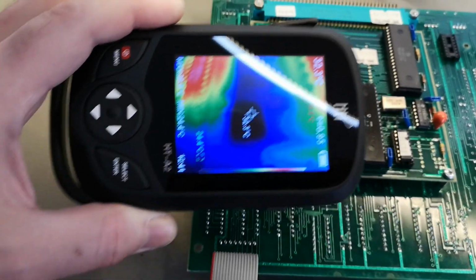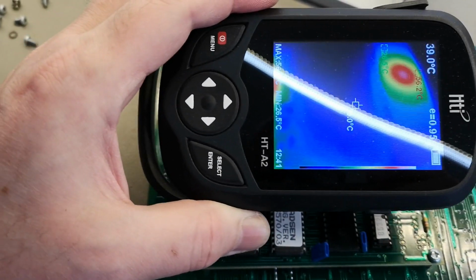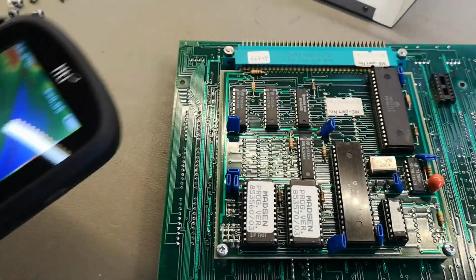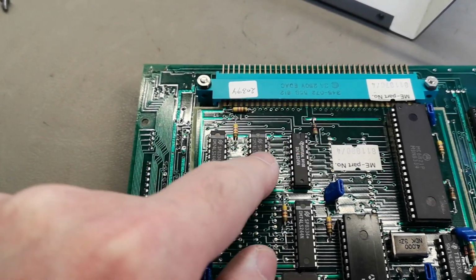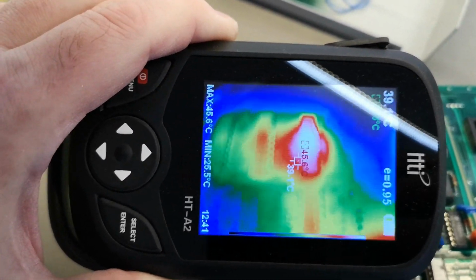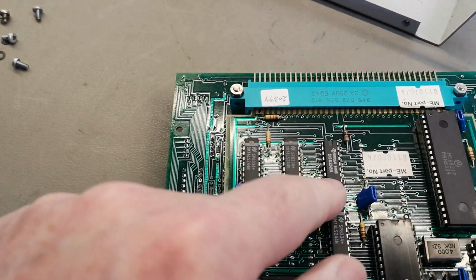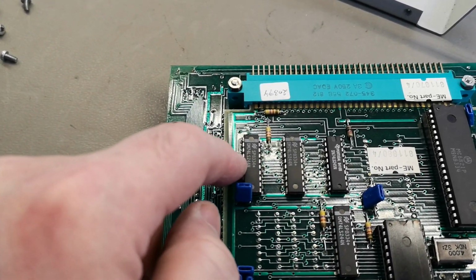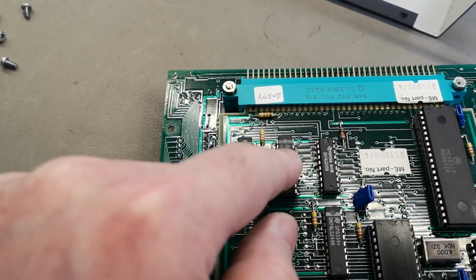EPROMs run quite cold. See, and there's nothing. There's nothing really. It's actually a little bit funny. This one goes quite warm, and those two are ice cold. Isn't that funny? Huh. So this is the one that is driving. They're actually also a little bit different, right? LS244, right? And this is a 245, so they are definitely different.